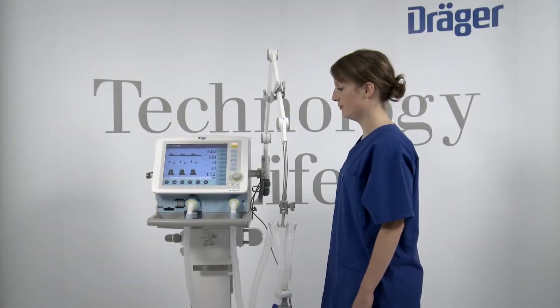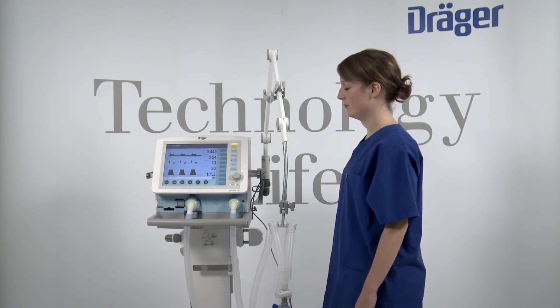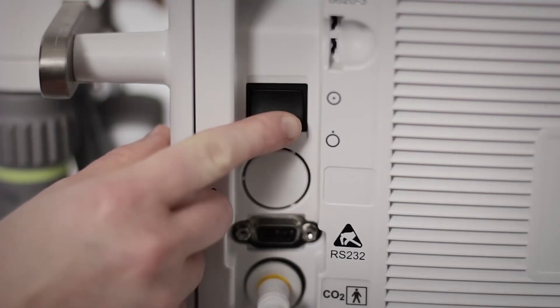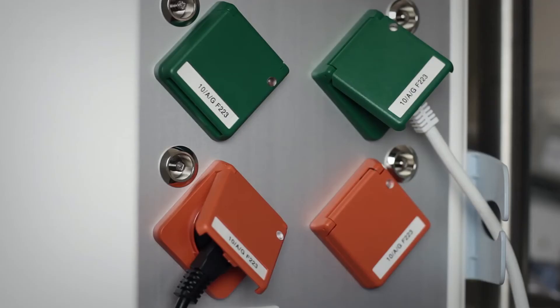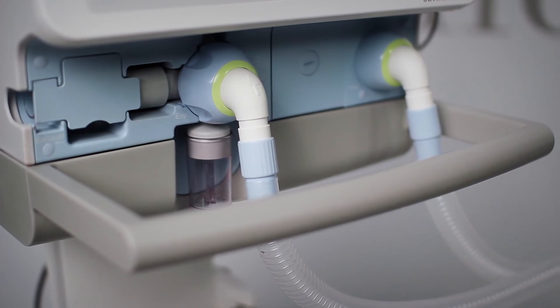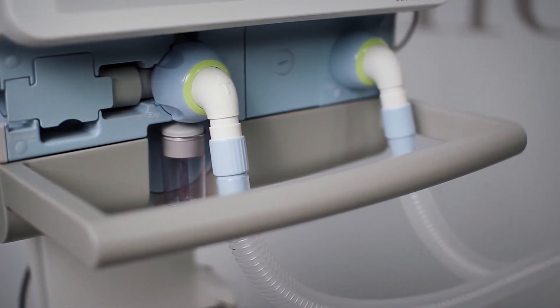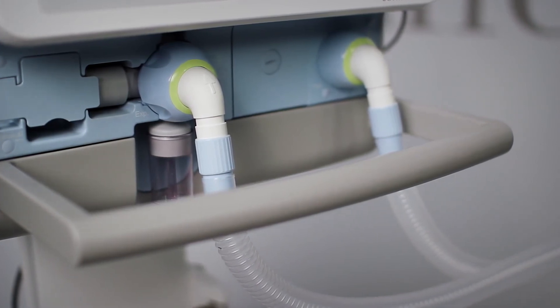This chapter describes how to disconnect the ventilation accessories, dismantle them for reprocessing and which reprocessing methods can be used. Before you disconnect and dismantle the ventilation accessories, switch off the device and breathing gas humidifier and remove their power plugs. Drain the water traps and breathing hoses and the water container of the breathing gas humidifier. Observe the hospital hygiene regulations.